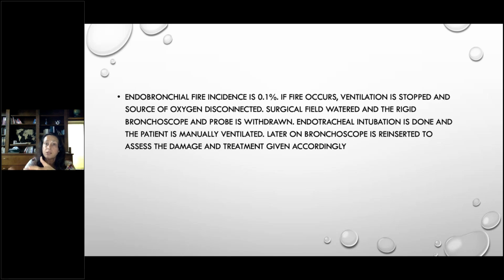So anesthesiologists should be paying attention, and we both should be doing things at the same time. So I would be stopping the ventilation and turning off the oxygen flow as you're flooding the field and pulling out the endotracheal tube. That again underscores the necessity for attention and the teamwork.